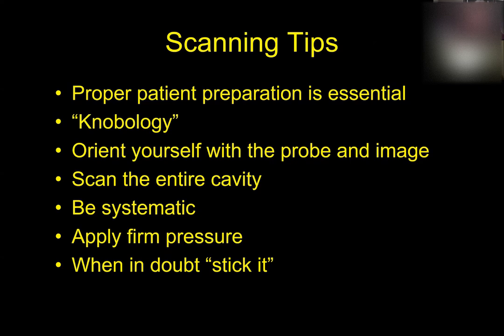So even if clinically you suspect the dog has a cystitis, it's probably not the best medicine or best practice to just scan the urinary bladder. We should probably go ahead and scan the remainder of the abdomen, especially if it's an older dog, because you might pick up early neoplasia in the spleen or liver that you didn't even have a clue was there. Okay. And the other thing is, again, you want to be systematic.